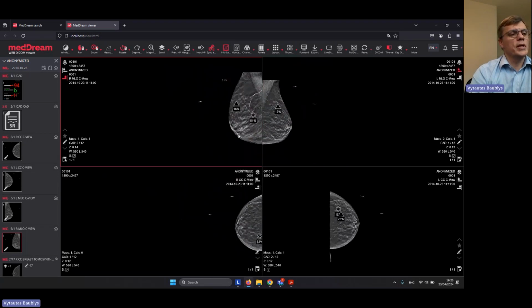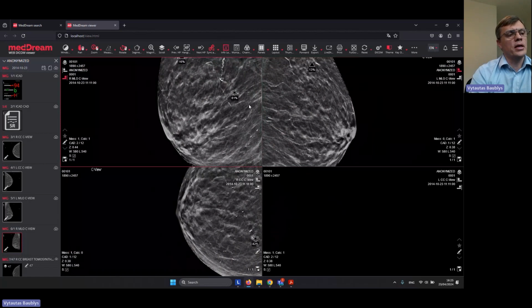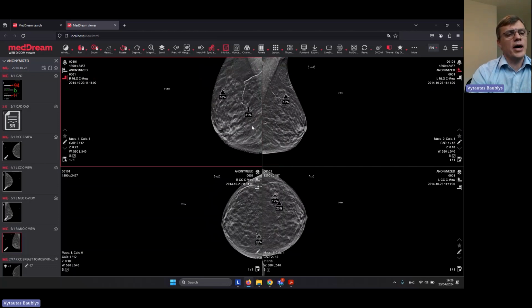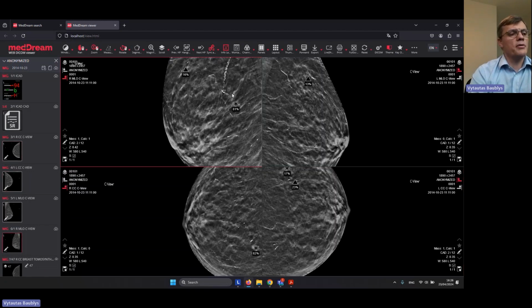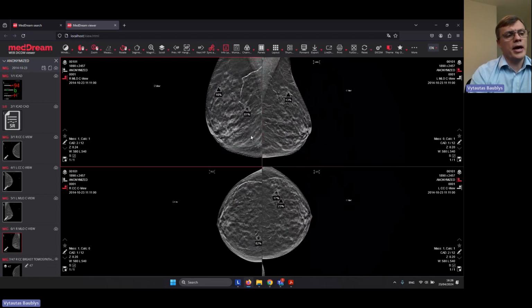Now when I zoom, you see it, the top image zooms correctly. So they both aligned, and I can move and propagate. And the bottom is unaligned, so it is impossible to use zoom synchronization. If now I do the same actions which I did in the top, I align the images, you see that data moved. So now I can work properly like on a professional workstation and zoom everything synchronously and have data.